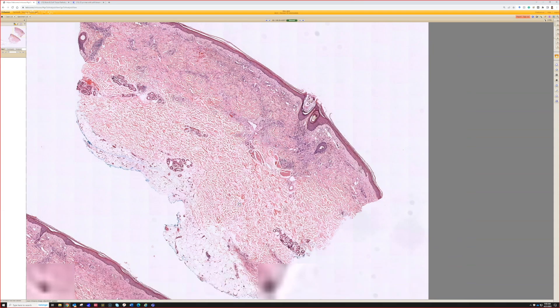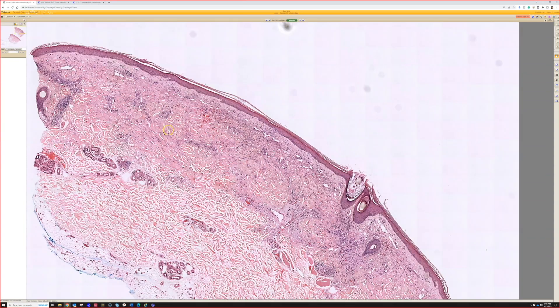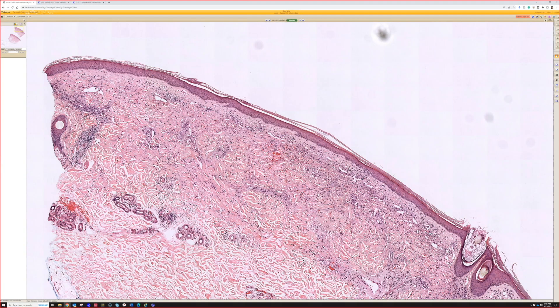In very early Kaposi's, the earliest patch stage can be extremely subtle and not have much of the sclerosis — those can be really easy to miss. This one is more obvious. We know something's going on here, and once you look closer and know to think about Kaposi's, it becomes pretty easy to make the diagnosis.